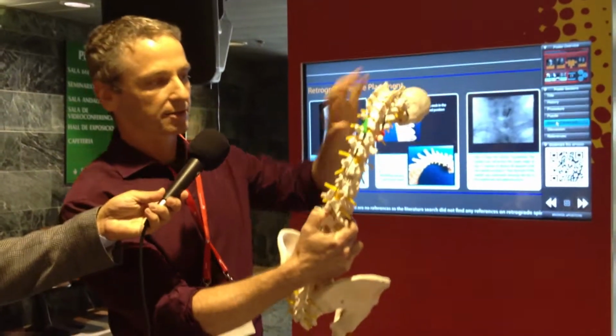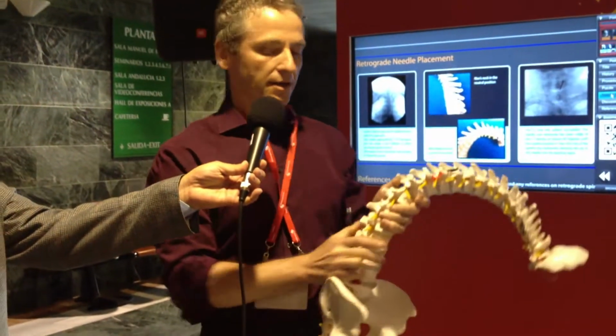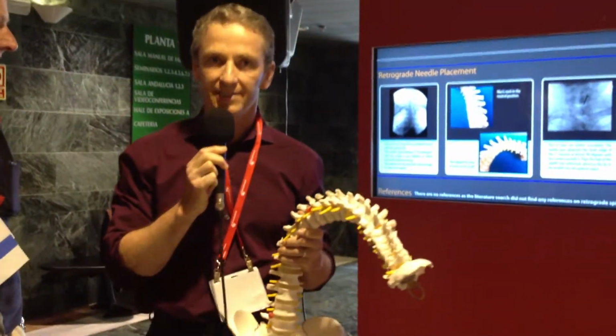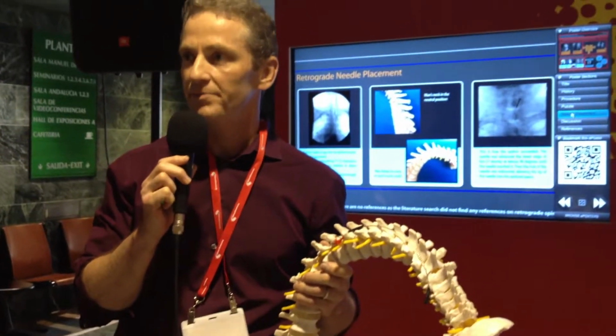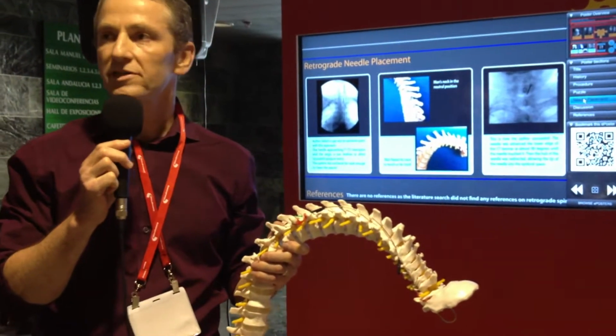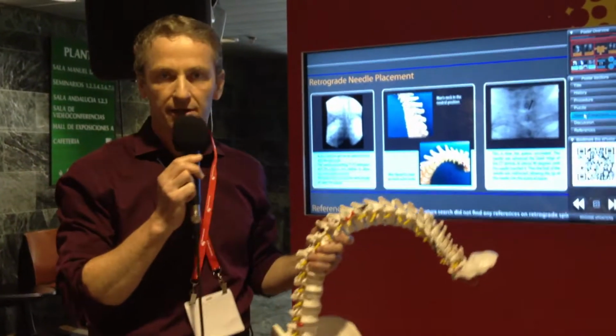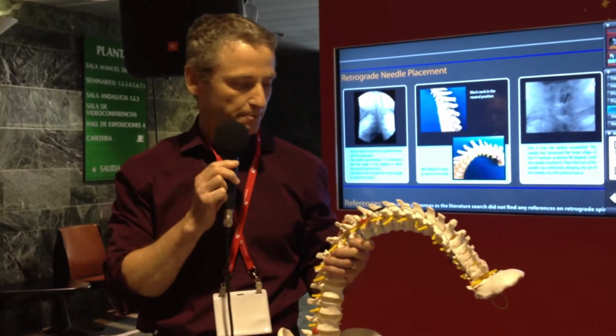And this is going to happen. So bending back will pull the spinal cord stimulator lead down. If the lead migration is significant, this could lead to lost pain coverage, and we'll have an unhappy Sam and a very unhappy doctor. I wanted to present a case in which creative thinking helped me, helped my patient, and possibly solved the problem illustrated by Sam.